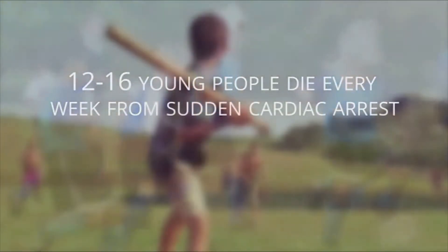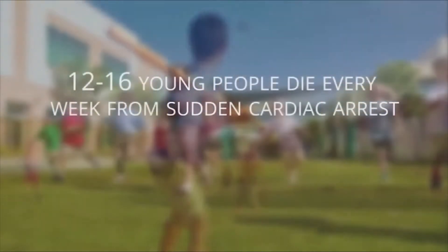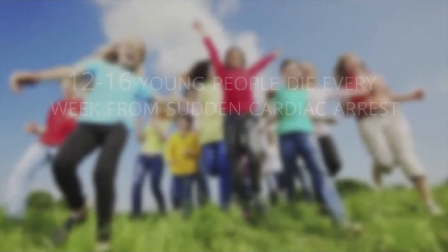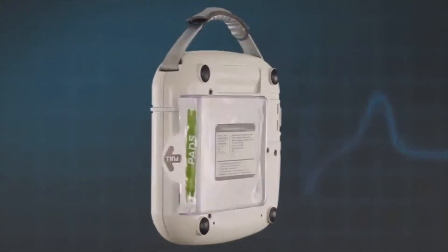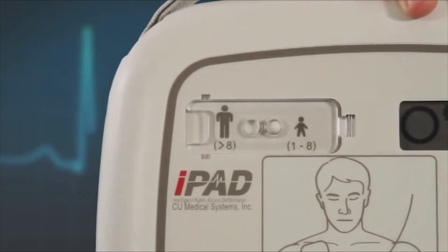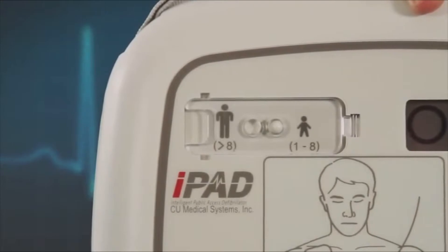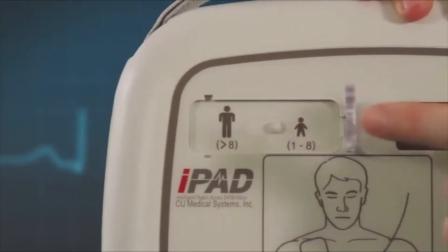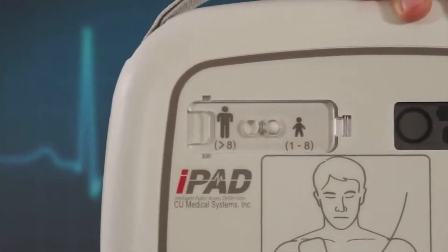Whilst the majority of cardiac arrests are on casualties who are of adult age, and the incidence of cardiac arrests in children are rare, they are on the increase. The iPad SP1 AED has a feature that allows it to be used on children should the need arise. There is no need to change the pads — simply lift the cover and slide the switch on the front of the AED to select child mode.